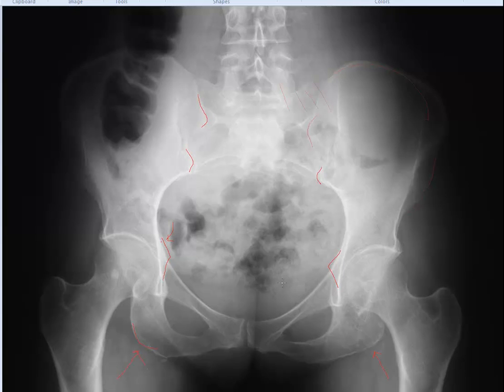Superior pubic ramus, inferior pubic ramus, and this is the pubic body. Pubic bodies come together to make the pubic symphysis. Here are the obturator foramina, which are bordered by the inferior and superior pubic ramus along with the most medial portion of the ischium.